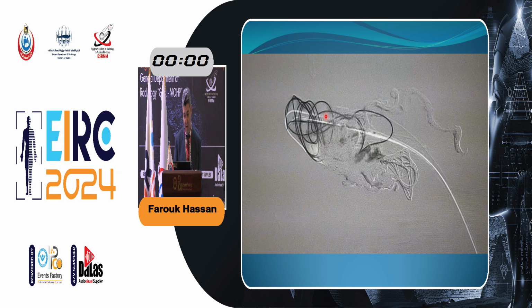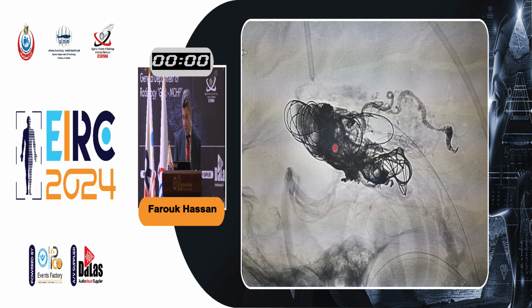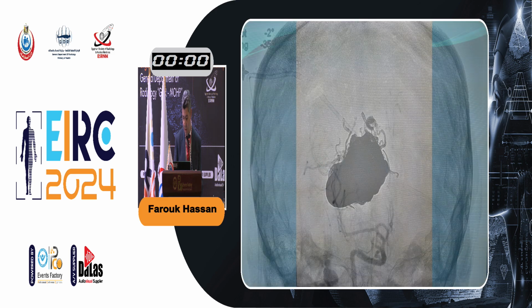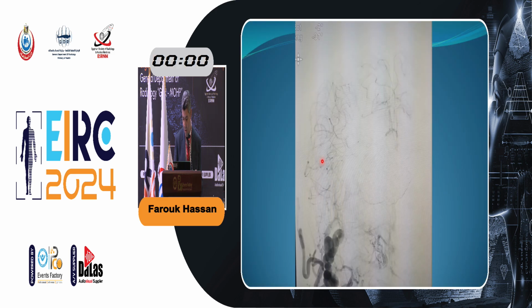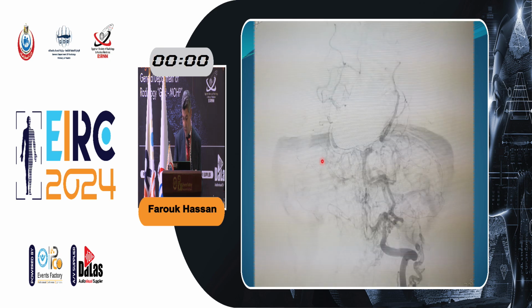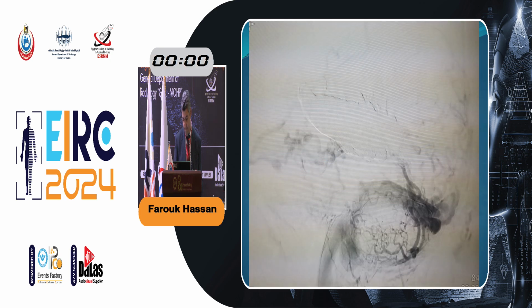It was not possible at the beginning, but when we have here some coils and Onyx, it stops the coils from jumping with the flow. And then we continue to inject Onyx, and this is after occlusion of the fistula. We can see the fistula is totally occluded and the patient is clinically fine. Thank you.